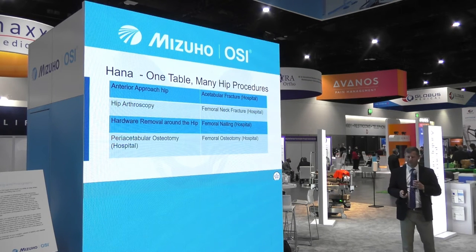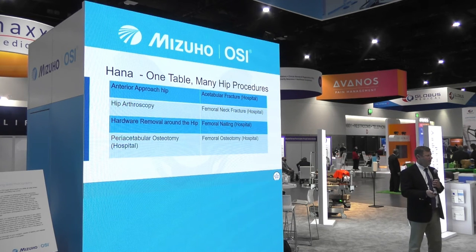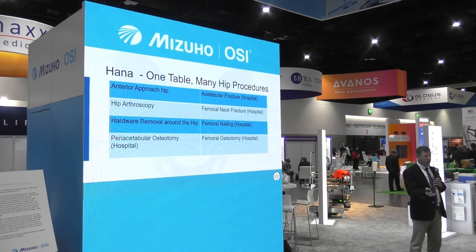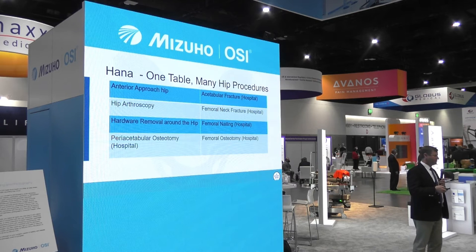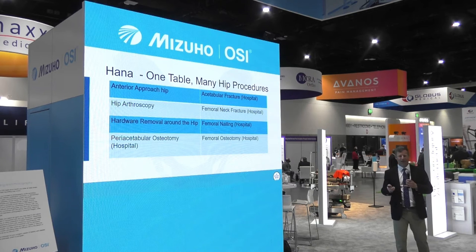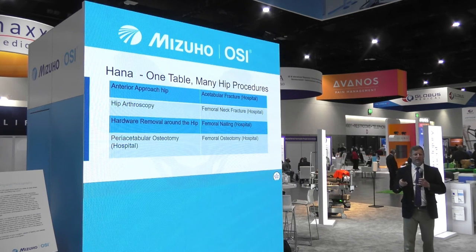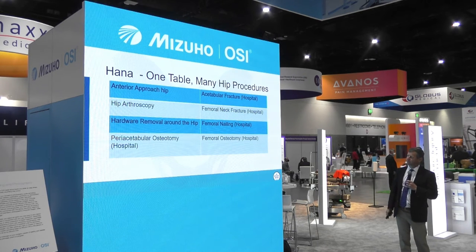If you're on an emergency case and you're by yourself in the middle of the night, I feel comfortable if they've got a Hana table. I know I can, by virtue of the setup, get reduction, and we saw those wonderful tips, was it yesterday in our other lecture. So these things are great to have in your back pocket, and they really assist and facilitate the procedure and minimize the reliance on staff to get these things done.